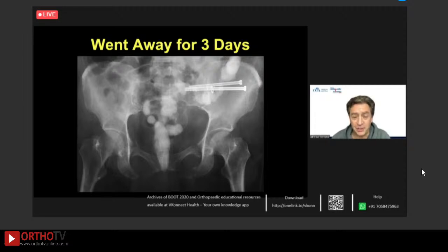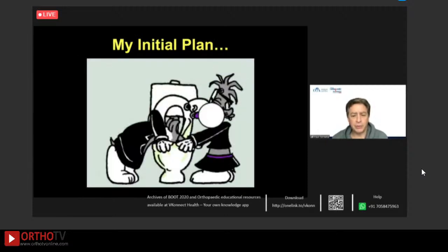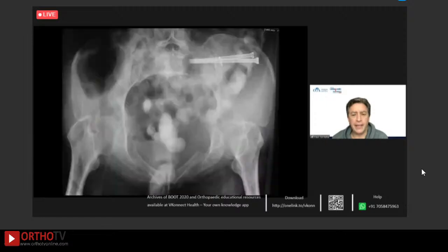So this is a patient, again, who's in the unit, in traction, theoretically sedated, so they're not moving because of their head injury, that obviously was bucking and moving around. But you can see the kind of early failure you get when you don't have enough stability in the ring. My first reaction was this, and then I had to think about, what am I going to do now?